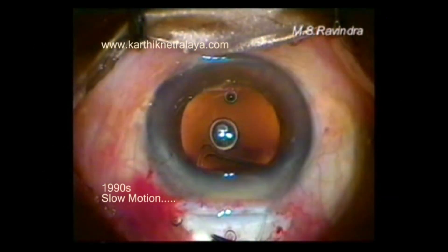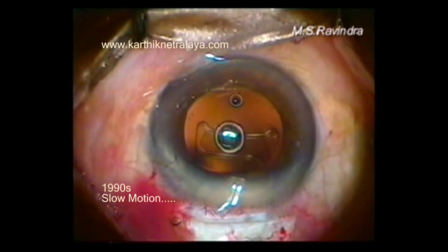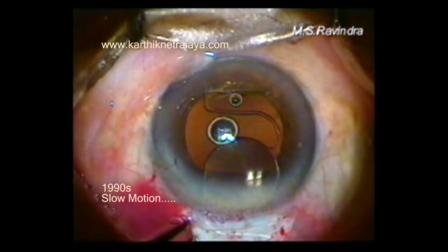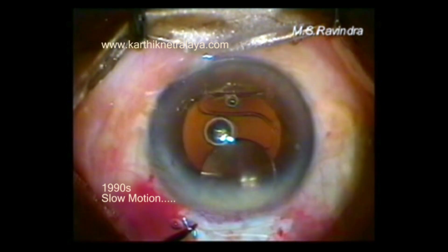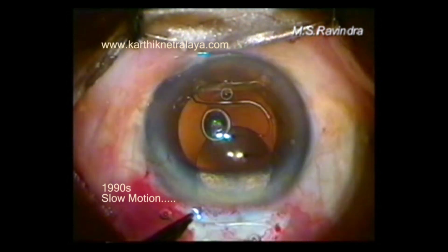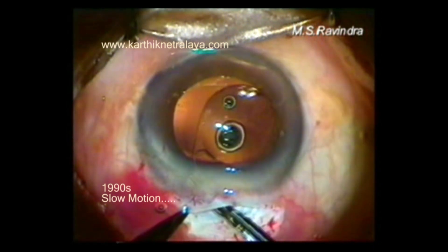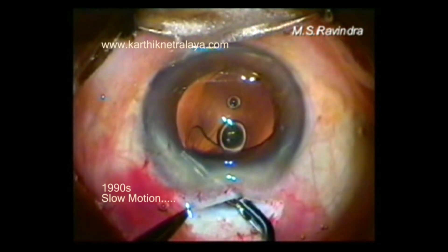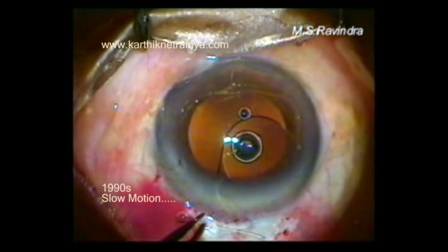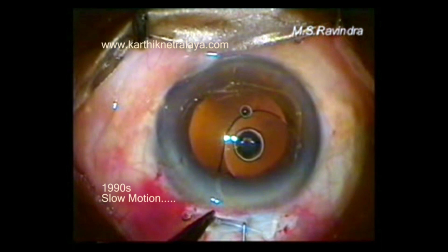This is the status where we have done a vitrectomy, lost the capsule, and the lens is very carefully guided within the viscoelastic so that the leading haptics go and impinge upon the anterior angle — the distal angle. There are two ways of implanting it: either hold the haptic and push it, or very gently insert it using a T-dialer. The T-dialer pushes it and each of the trailing haptics is inserted into the angle region.